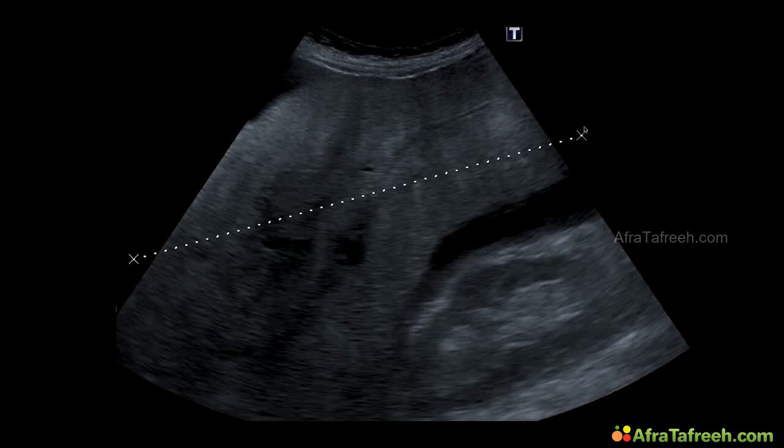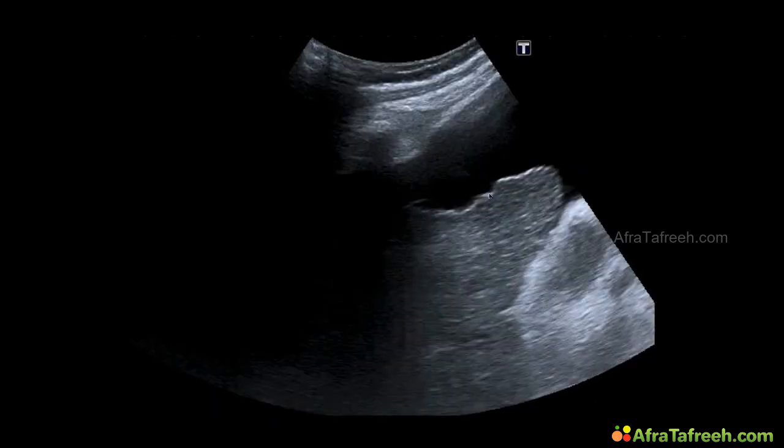Liver veins are narrowed. Again, an inhomogeneous texture of the parenchyma, here ascites, and the irregular contour. In this picture, because of the ascites around the left liver lobe, we can very clearly see the little humps of liver surface. No smooth capsule, but an irregular one.